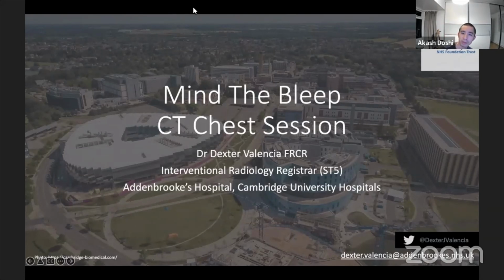Welcome to the next webinar in this Mind the Bleeps radiology series, which aims to cover all the imaging modalities that doctors and healthcare professionals will come across in the hospital. I'm hoping that we'll have seen some of you before. This is the last webinar in this radiology series. Over the last 3 months, we've so far covered pretty much all the plain films that junior doctors will see in the hospital, as well as covering CT head, abdomen and pelvis, which Henry took us through last week. So today we'll be continuing with the CT section of the series.